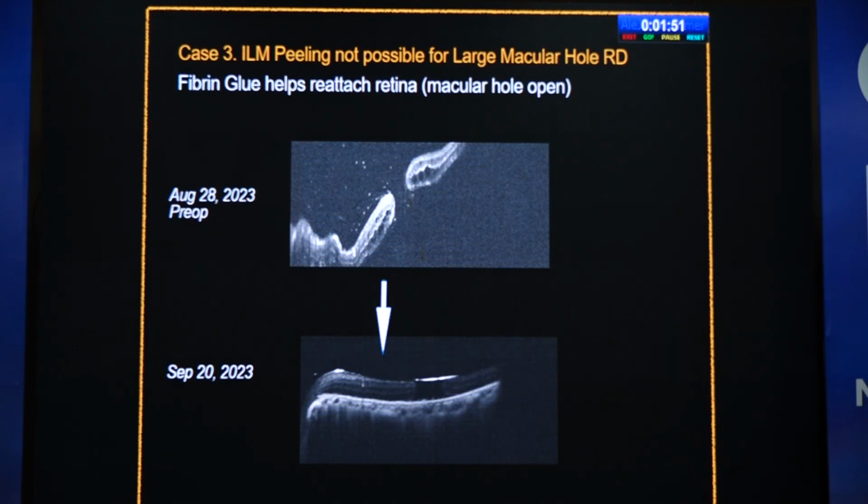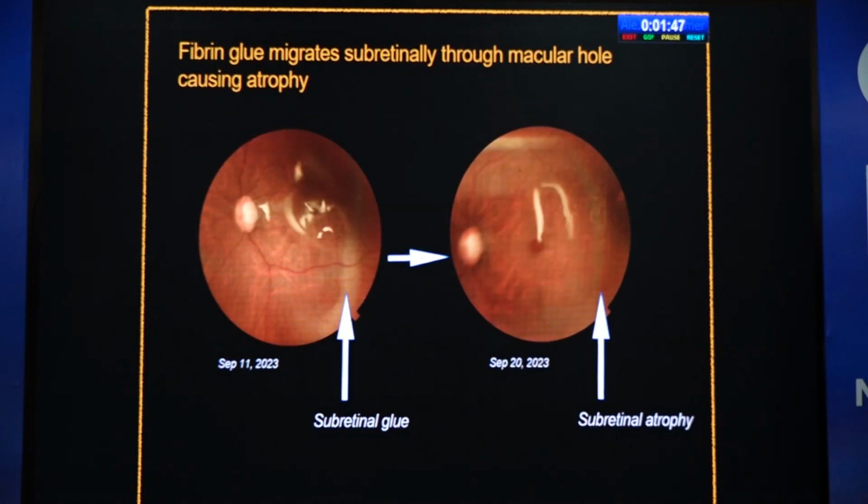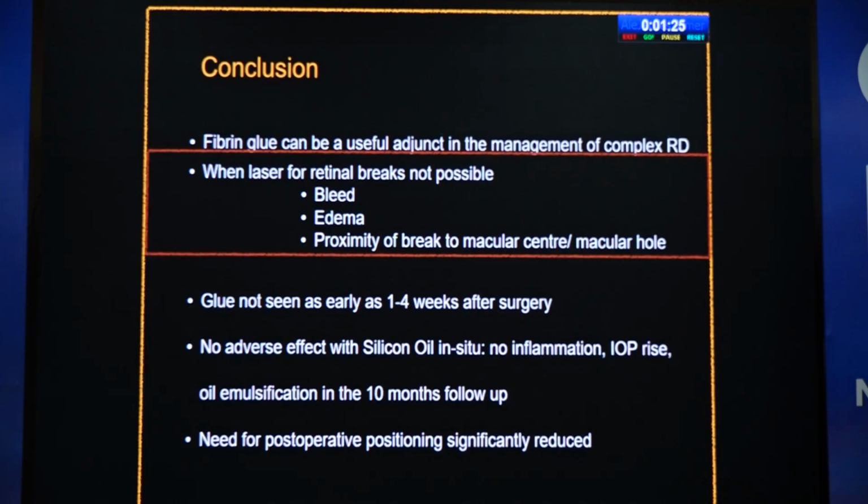Another patient, here the hole did not completely close, but at least the retina got attached. What we saw in this patient in the first post-op period, through the macular hole there is subretinal glue, as you can see the track. And within 10 days we can see that the track has become atrophic, subretinal atrophy. So this is a word of caution that when we are injecting it for macular holes, probably it will cause atrophy around the hole and affect the vision finally. This is the first time we could document atrophy at the site of subretinal glue. So it's good for peripheral breaks at least, but probably not for breaks close to the macula.